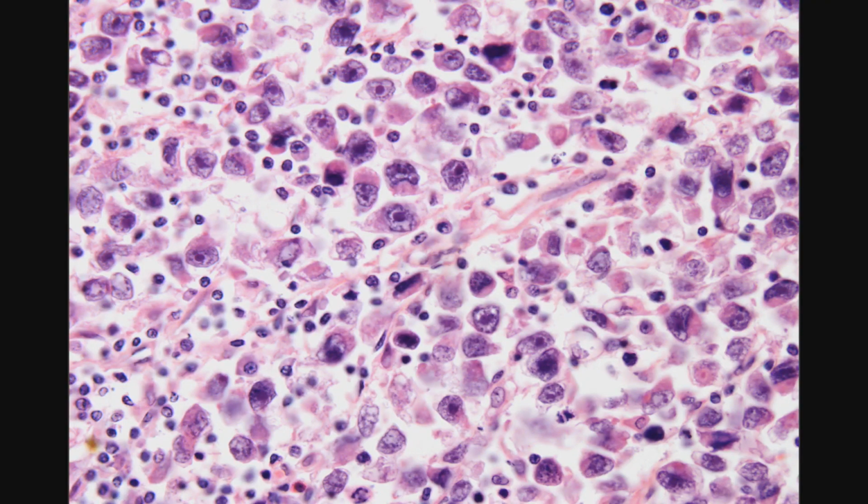One of the pitfalls, so that's the typical seminoma, but be aware that there's a spectrum of atypia in seminoma. There's a seminoma that in the past was called anaplastic seminoma. A synonym was high mitotic rate seminoma, where the cells look more pleomorphic than your usual seminoma. They still have that nice central nucleolus. They still have typically a sprinkling of lymphocytes, but just more pleomorphism, and you'll often see an accompanying increased mitotic figure. Again, loosely cohesive. Just be aware that seminoma may have this more pleomorphic variant.